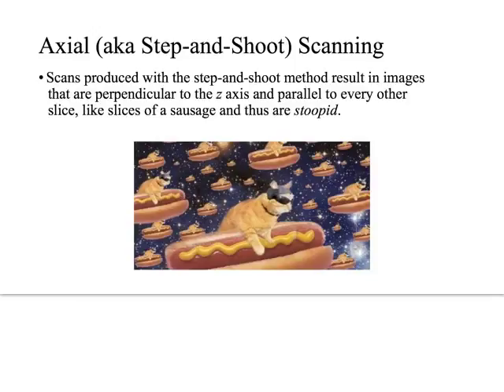If you go to just about any facility, like for example Baptist Memphis, not to call anyone out, they are still doing axial scanning of the head. Why? If you ask any of them, do you call yourself a CAT scan tech? They'll say no, right? Why are you doing axial scanning then? That's what we've always done.